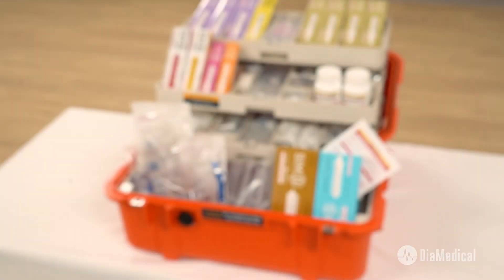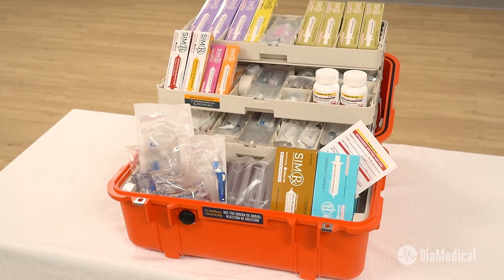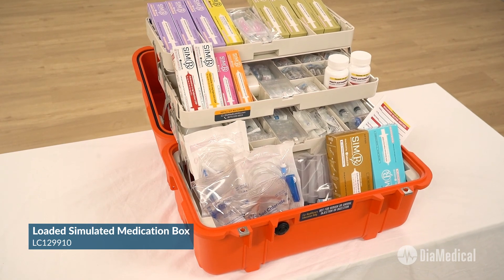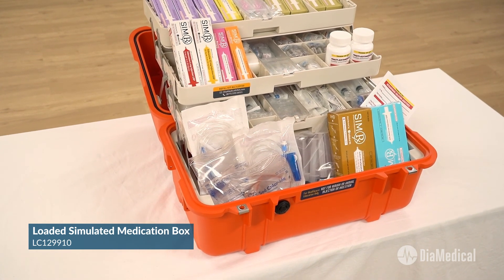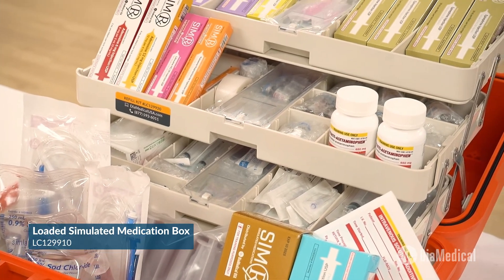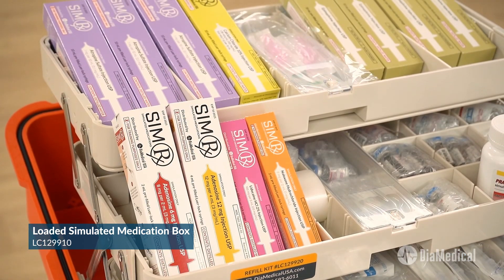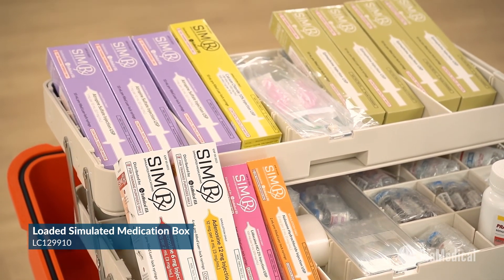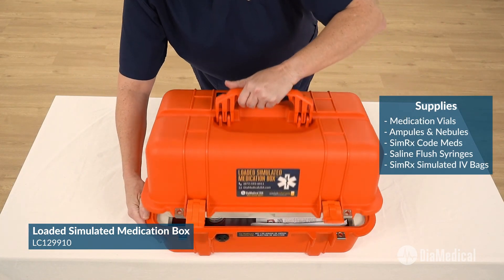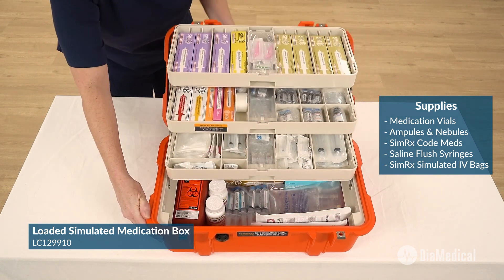The SimLab Solutions Loaded Simulated Medication Box contains all of the most commonly used pre-hospital drugs. It features simulated medication vials, ampules, and nebules, along with SimRx code meds, saline flush syringes, and IV bags. All of the medications fit perfectly in the hard-sided Pelican protector case that was specifically designed for EMS personnel.